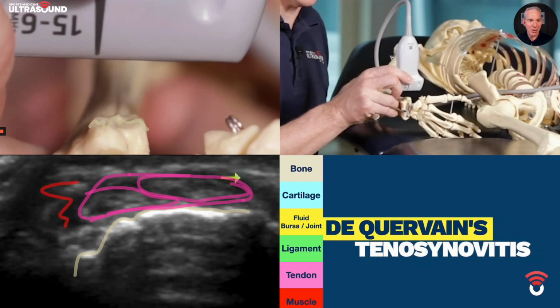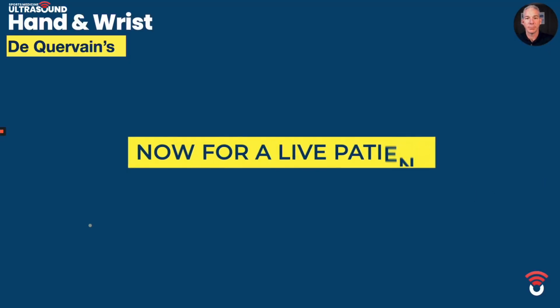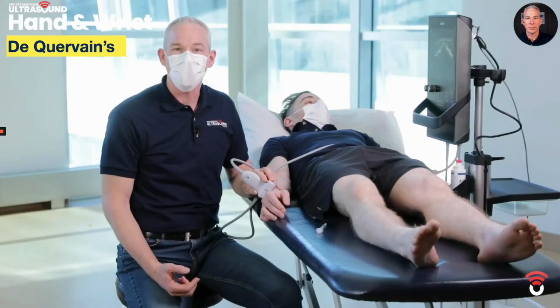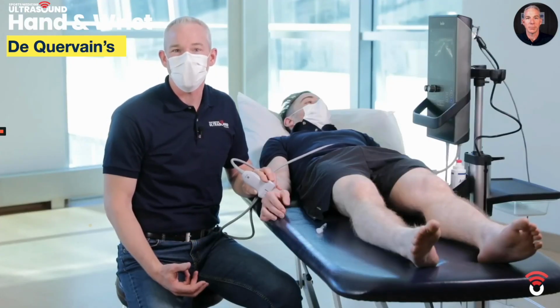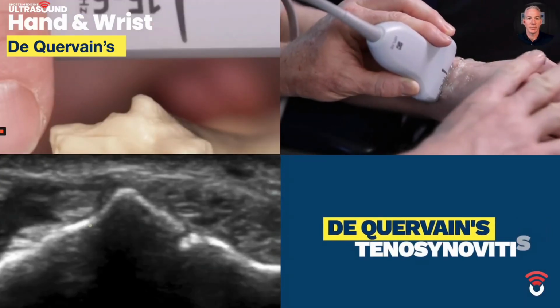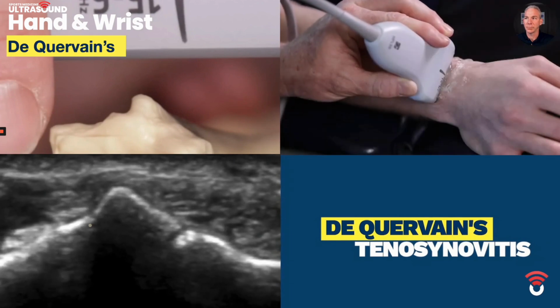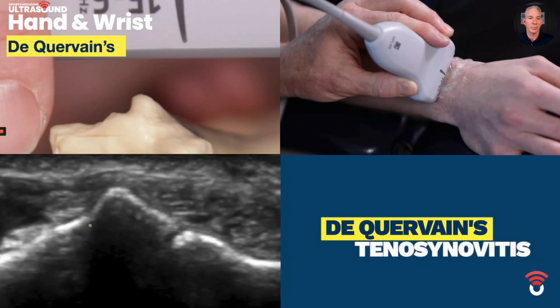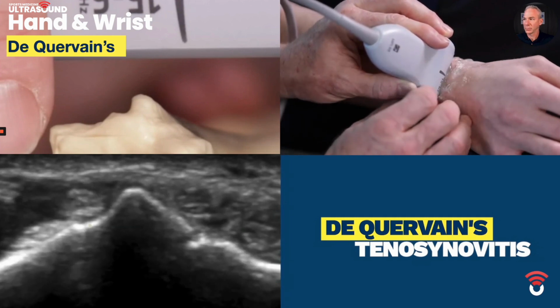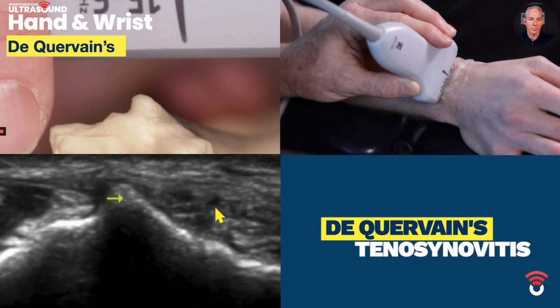Okay, it is now time to see what it's like in a live patient. I'm going to show you how to scan and inject the Quervain's tendonitis. I usually like to have my patients supine with the palm about like so, almost like holding a cup. Some practitioners would prefer to have their patients seated across from them. But either way, I normally like to start on Lister's tubercle, which we see on the screen here.